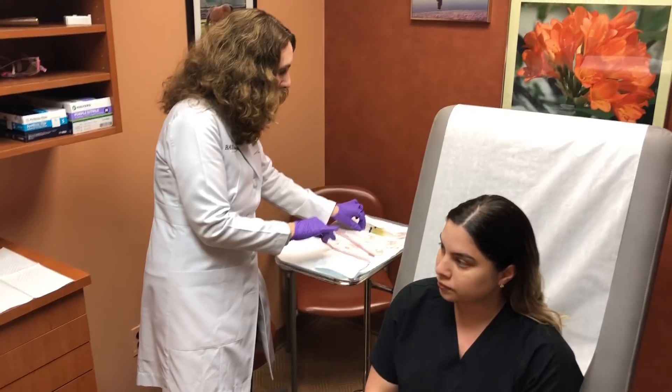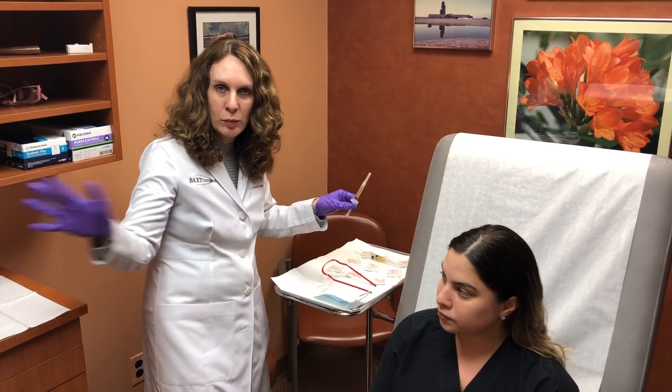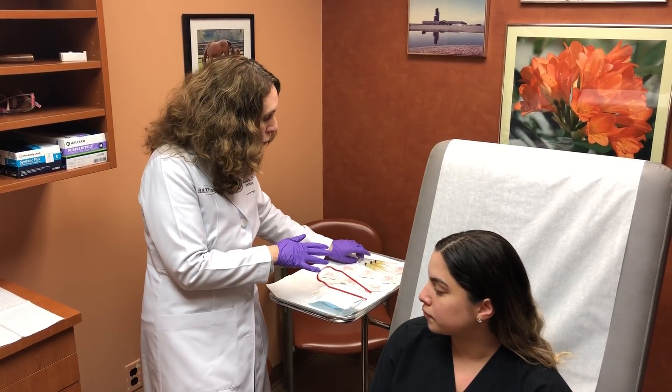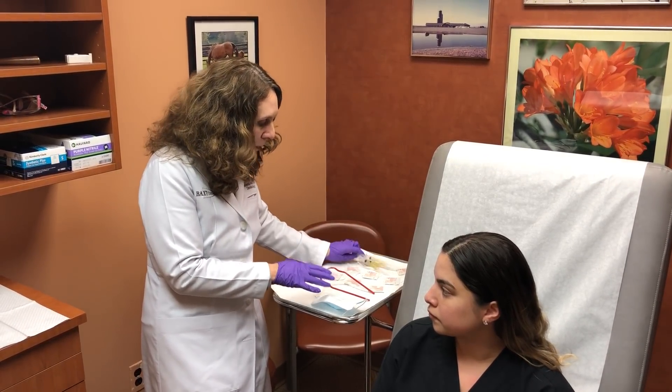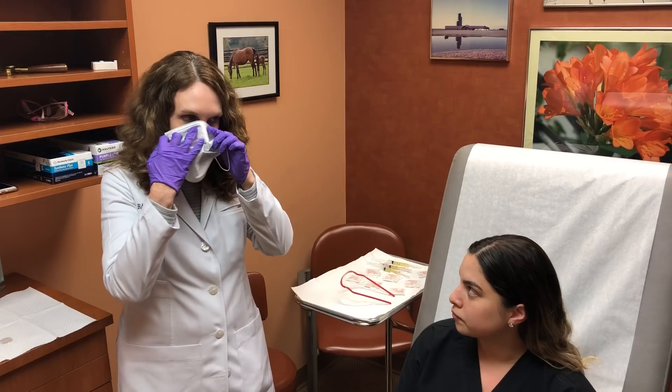As you can see here, I'll just hold up the serum so you can see what it is. It's just a clear yellow fluid — it's your own fluid. You're the only person in the room; we take your blood, put it in the centrifuge, and this is what we get out for the platelet-rich plasma. It's usually a few cc's, and I'm going to inject that.